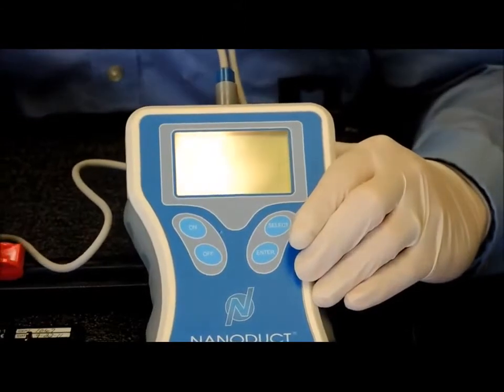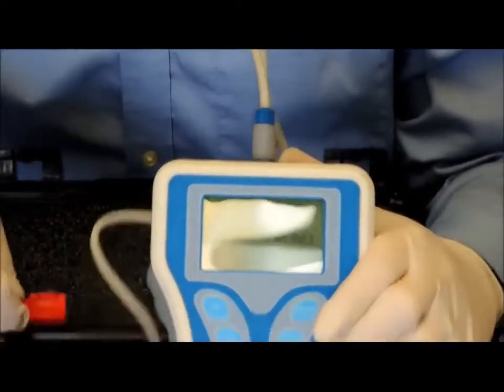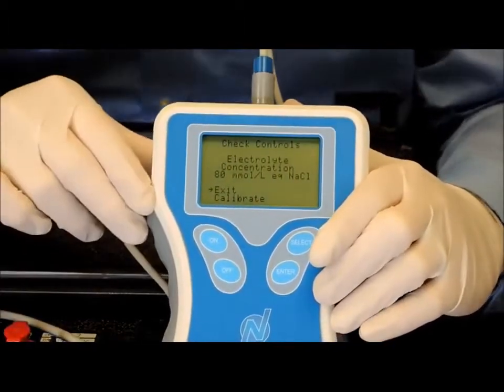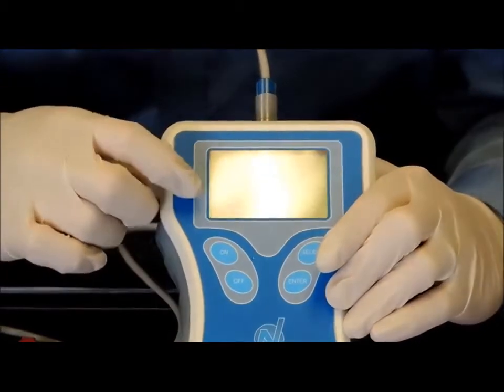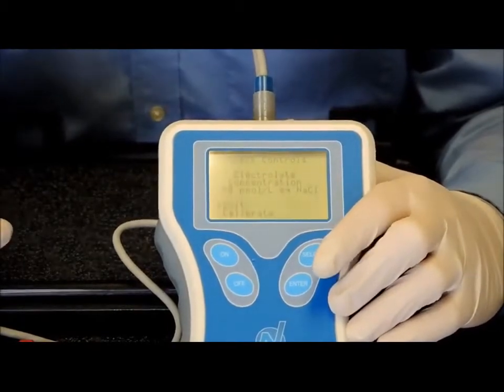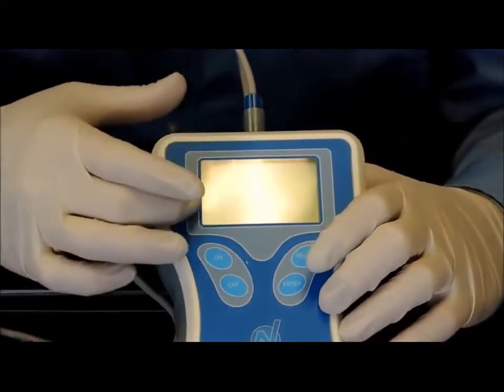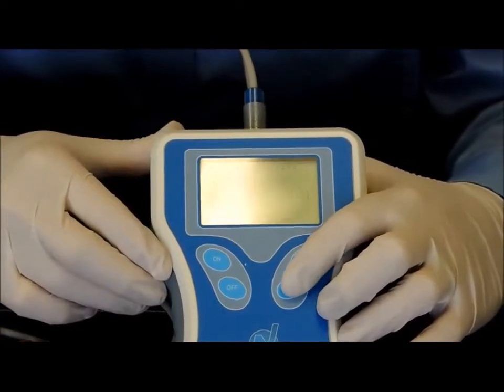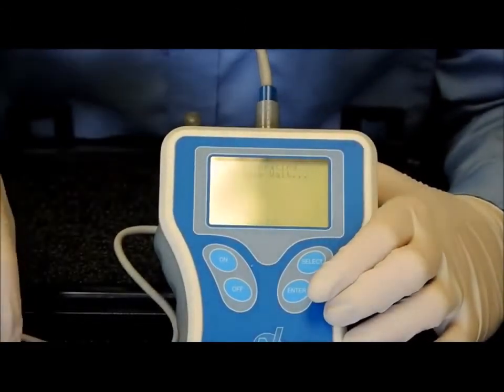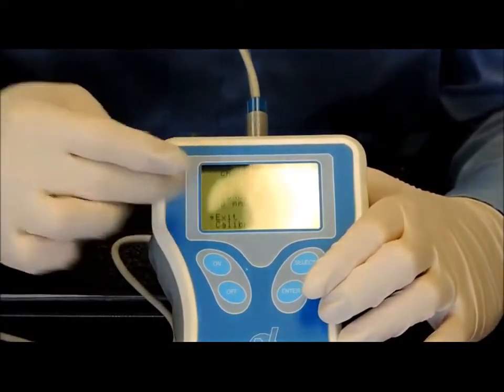The first value you should measure is the 80 value right here. That's the only value that you can calibrate on. So we attach the sensor to the 80 value, and the screen will show the value when it's attached, and it does read 80. I'm in the habit every day of still calibrating even though it reads 80. So press select to move the arrow down to calibrate, and then I press enter. It will go through a process of calibrating to the built-in resistance that's in the calibration plate. Okay, now it's calibrated. It's still reading 80.